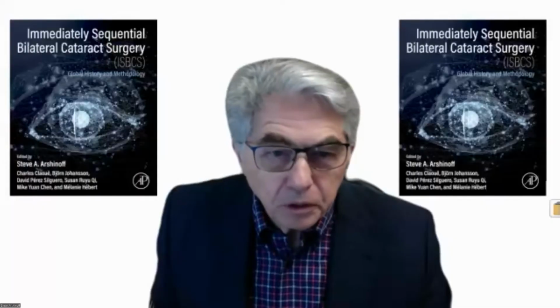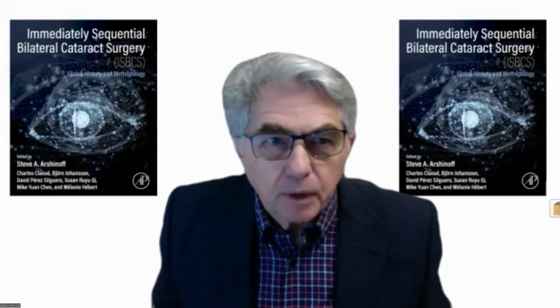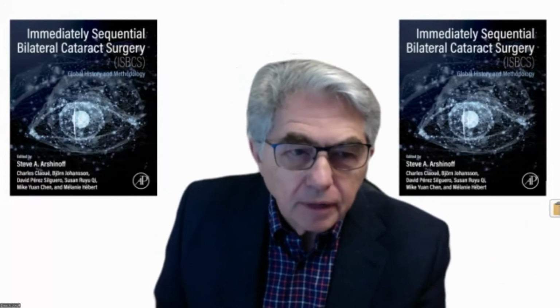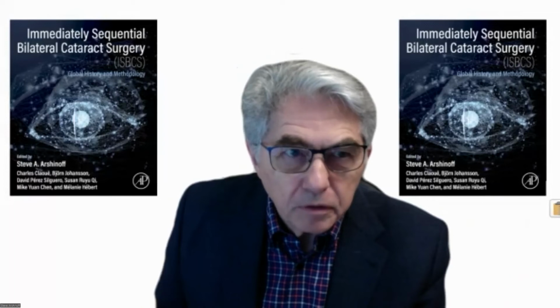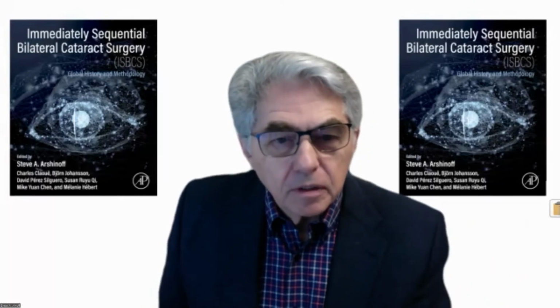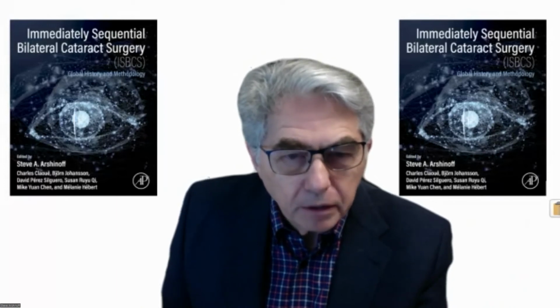Well, that's a whole new lecture, but basically it goes like this. Yes, I always modulate my phaco power, and I actually custom set my phaco machine to my own design delivery of power, so that it's always on pulse, and as I put my foot pedal down to increase the power, the spread of the pulses goes further and further apart. Because when you want high energy in a dense lens, if the pulses are very rapid, the lens chatters. So if you spread the pulses more, the lens doesn't chatter and comes back to the phaco tip.